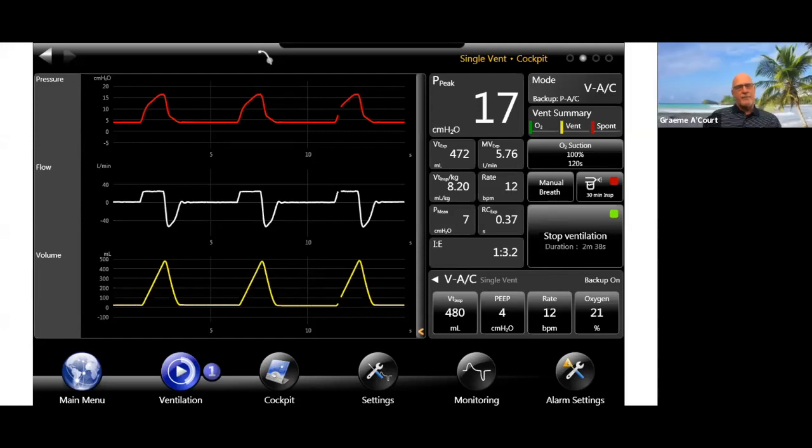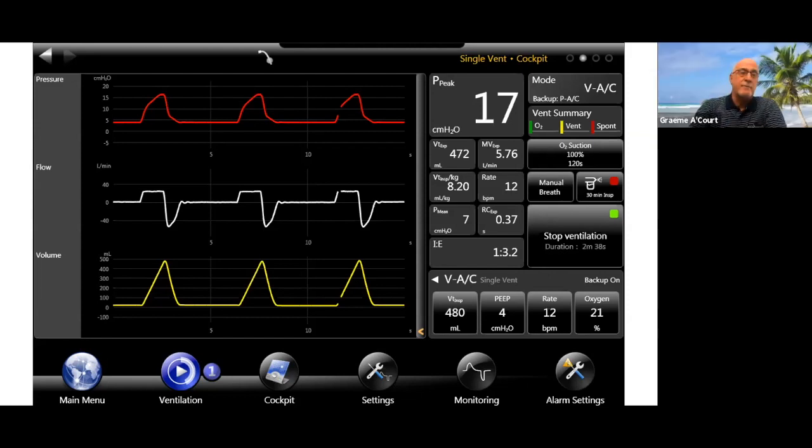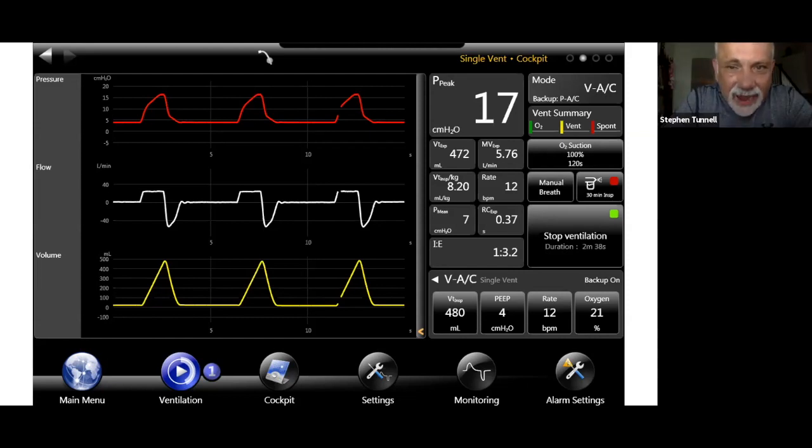But I would still say that the major things we use to guide and make changes on the ventilator, most of the time are related to trend. There are absolute values that are obviously important. Gas exchange is obviously important, but whether it's 16 and a half and then the next breath 17 and a quarter, those sorts of preciseness do vary in ventilators.